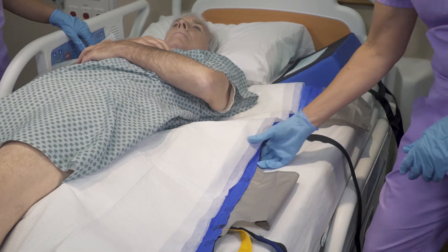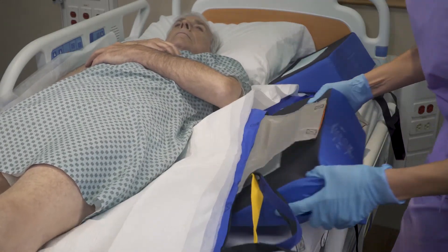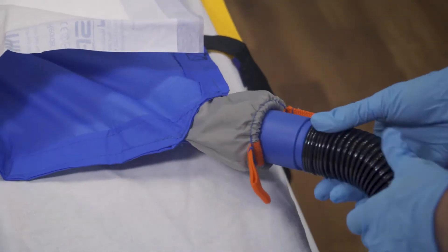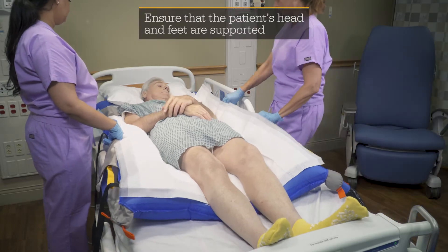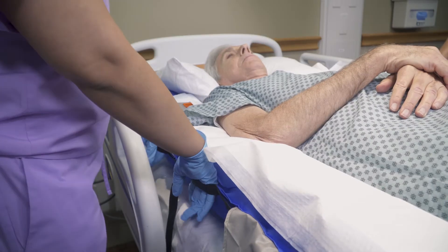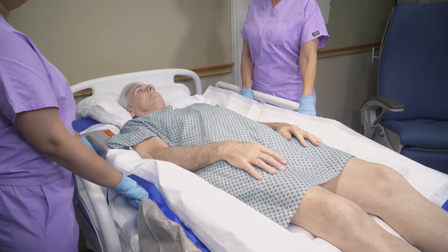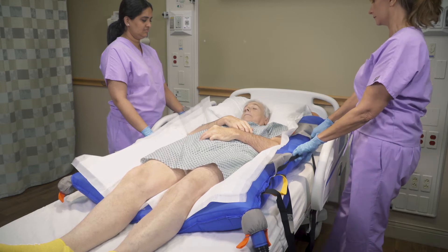Check that the patient is aligned with the head indicator on the glide sheet. Remove wedges if present. With the power off, insert the air pump nozzle into the quick connect valve and make sure it is secure. Turn on the air pump and allow the glide sheet to fully inflate. Using the perimeter handles, line up the patient's hips with the hinge point of the support surface.